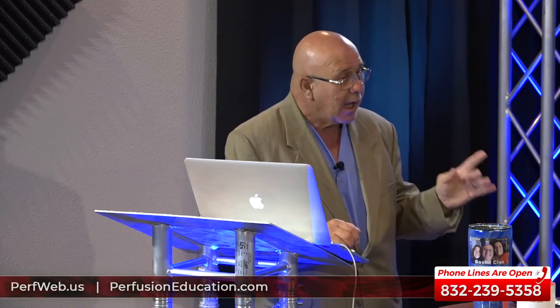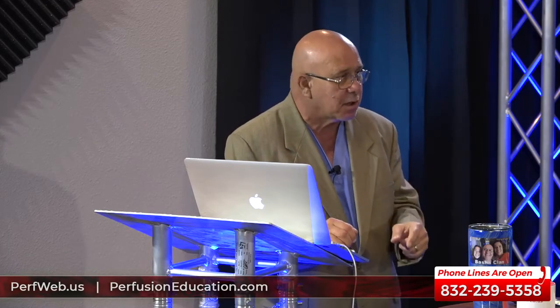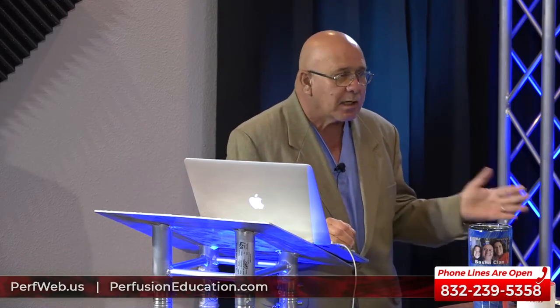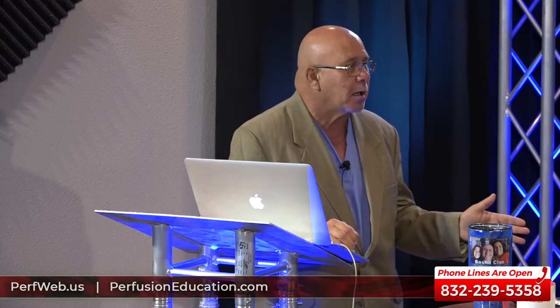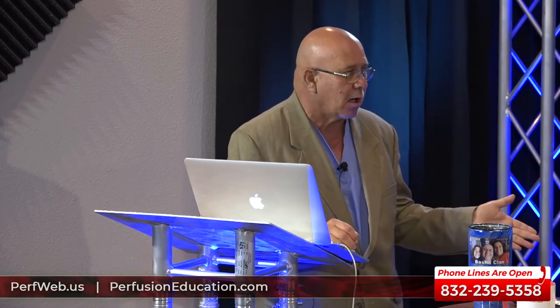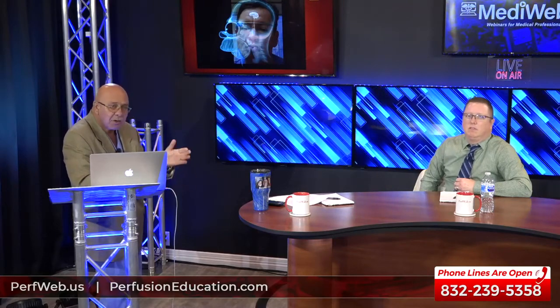The other one had to do with what you're talking about. Leave the suckers on, leave the suckers on, until they had 50% of the protamine in. And then we had to go back on pump, and the pump was clotted off. You don't have to have it happen to you very often. I've physically had it happen in my professional career, where the pump has clotted off because they left the suckers running while the protamine was being administered. No more, I won't do it.